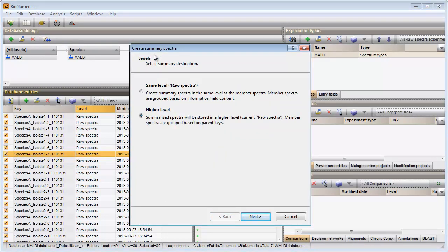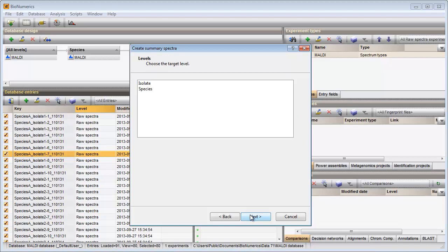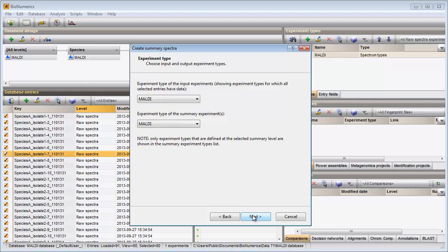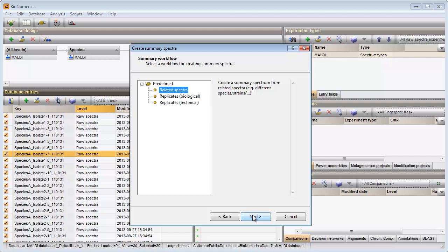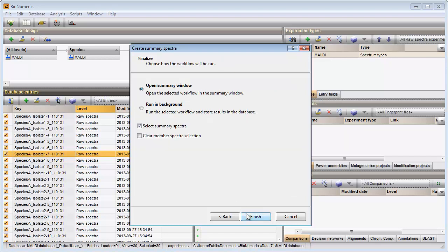Since I want my spectra to be stored in the isolate level, I make sure a higher level is selected, and I choose isolate in the second step. The summary spectra will be stored in the MALDI experiment type. In the last step I choose one of the predefined workflows and press Next and Finish.